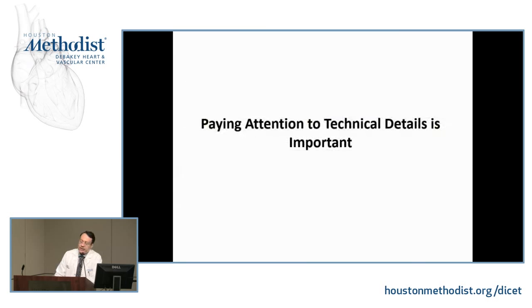Paying attention to technical details is important. So we said clinical is one piece of it. I just gave one example. There are many others. Paying attention to technical details is important, both on the side of the sonographers as they are acquiring the signal and on the side of physicians when they are going through these signals. Just because you have something presented to you does not mean you have to use it.